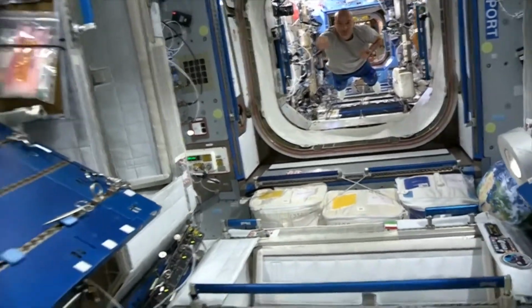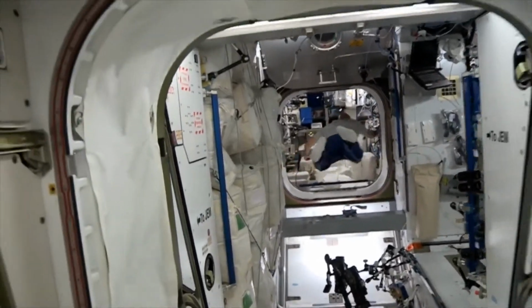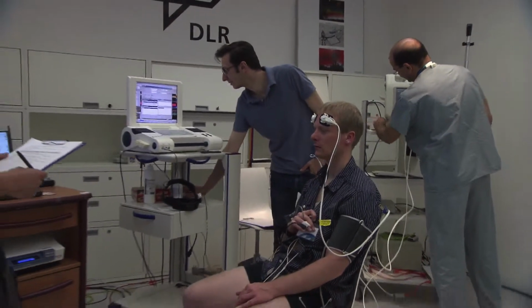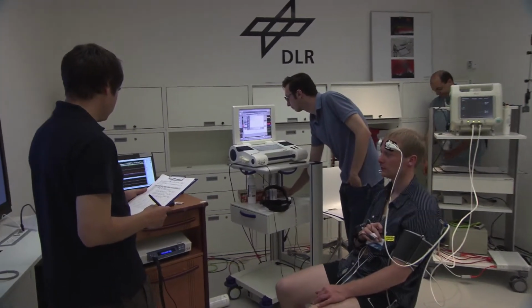If I may add, we planned a lot of studies at the DLR, be it bed rest studies or ambulatory studies. We've never put together a study quite like this with all the experiments that these subjects have to endure. It's quite rigorous. This study is important for spaceflight because we see that the astronauts that come back have high intracranial pressure, and we don't know exactly why this happens, if this has something to do with brain perfusion. And so we measure this on our subjects. The TCD is important for this because it is an established device to measure perfusion, and we can compare it with other devices that are new.